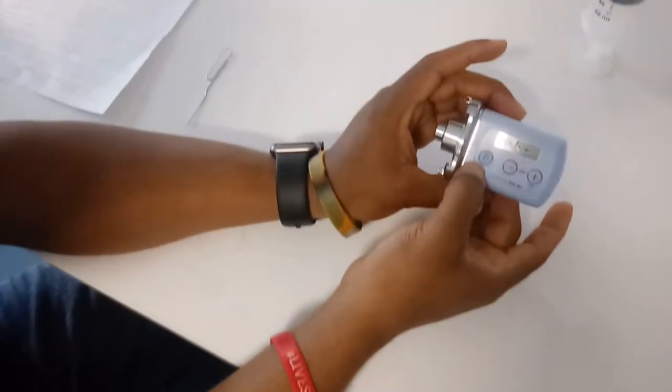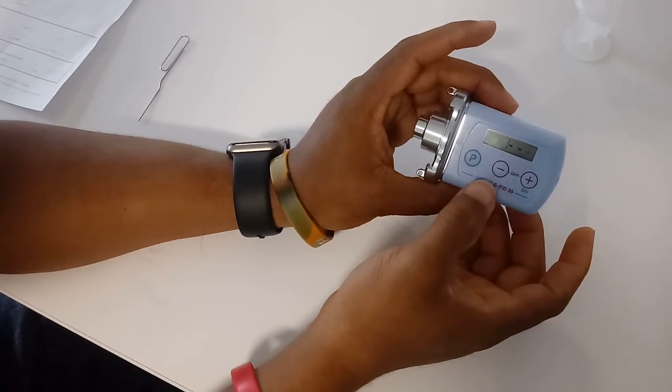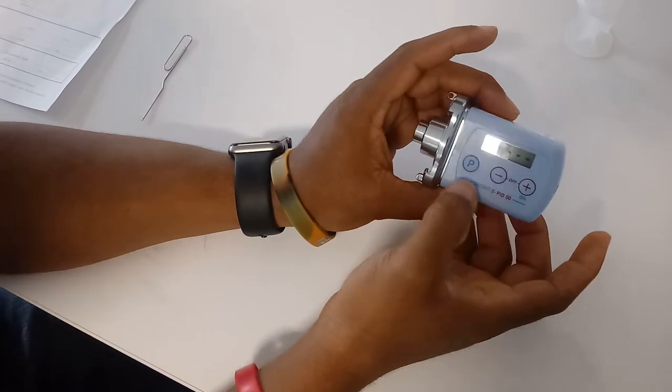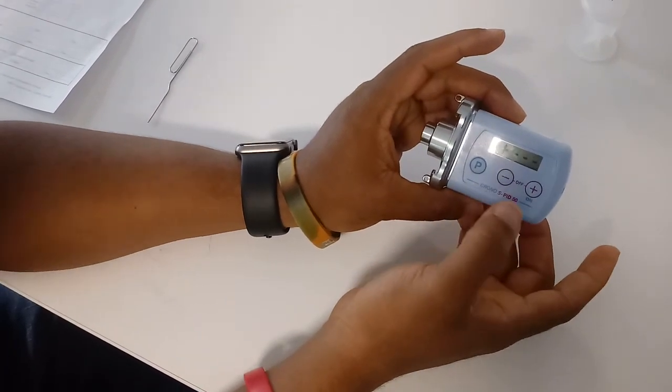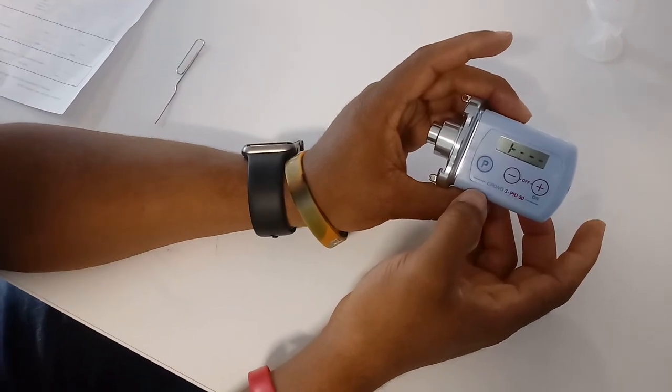So once again, you hold the P button until you hear it beep. It will start to blink. Once it starts to blink, you hit the minus button and that will change it from the flow rate to the time rate. You can do the same thing backwards, from time mode back to flow rate mode. That's how you do it.